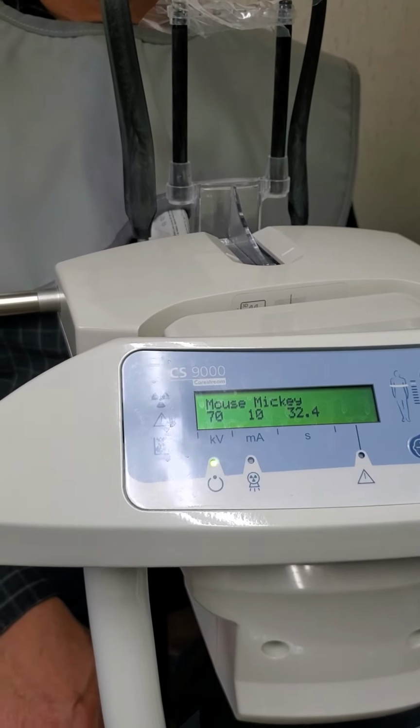Okay, so let's say we're going to do an upper full arch now. If you look at the position of the patient, in order for them to bite on that bite stick, they're going to have to go way down like this. Right? So we use our machine height adjustment to bring that into line with the patient. Upper arch or lower arch, we want the occlusal plane of those teeth to be parallel with the floor.